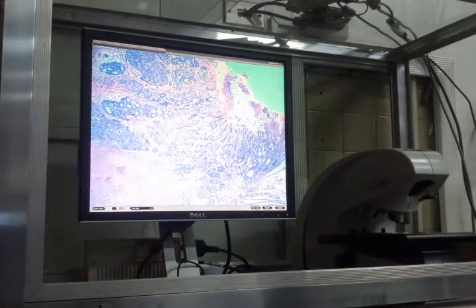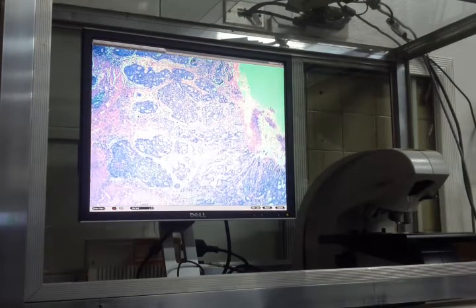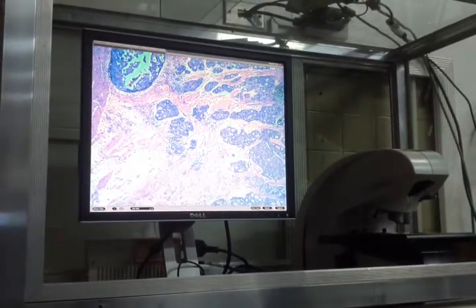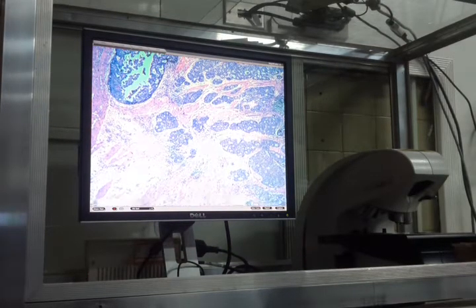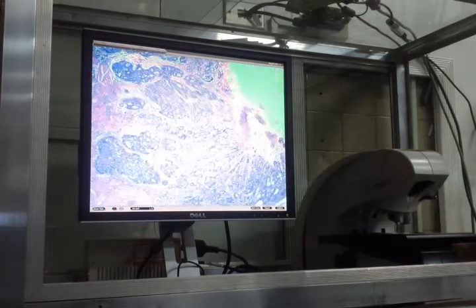Okay, this also came from the colon, but apparently, the layer we are in now is the muscularis externa, the muscular layers. You even have a portion here with the Auerbach's plexus. Okay? Tissue of origin. Anong tissue of origin niya?